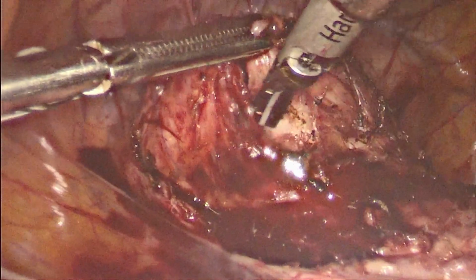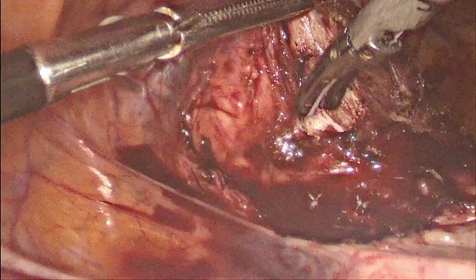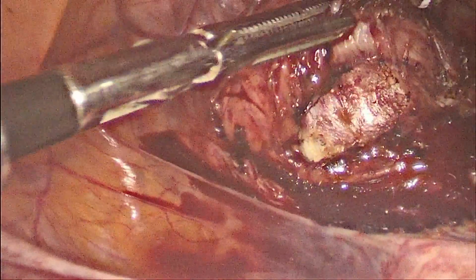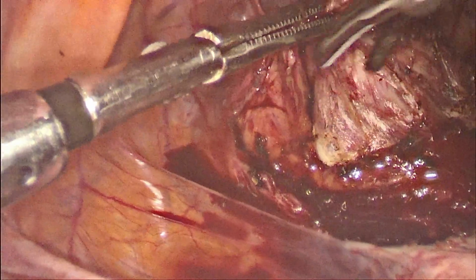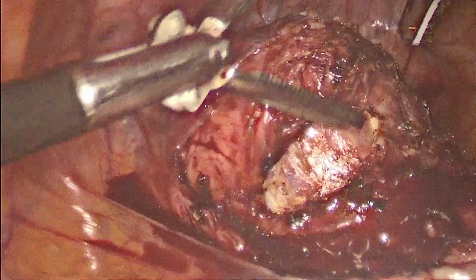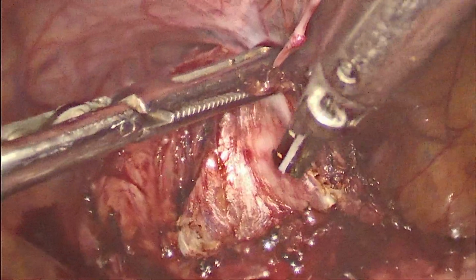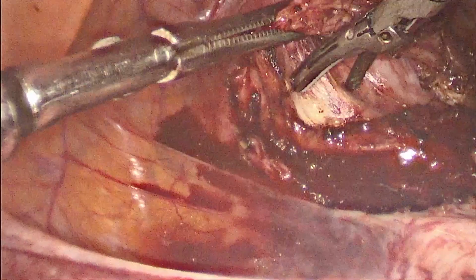A smooth, shiny cervix is very clearly appreciated now. So now that we are in the proper plane, the dissection can go a little faster.